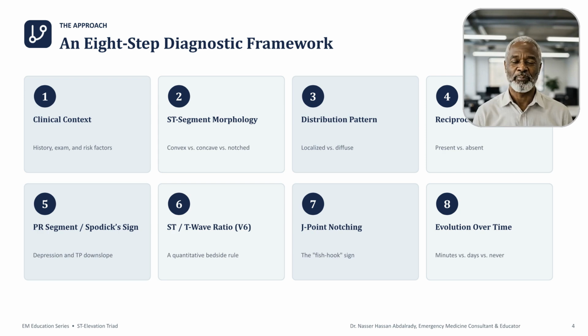This 8-step framework provides a reproducible approach to differentiation. By systematically evaluating context, morphology, lead distribution, and evolution, you can arrive at an accurate diagnosis with greater confidence.